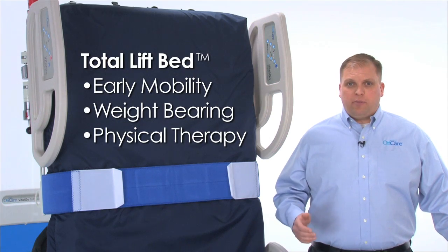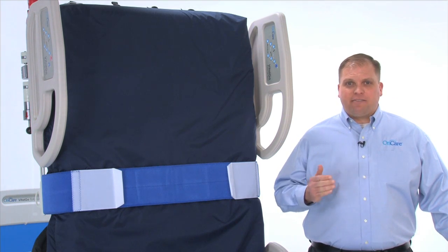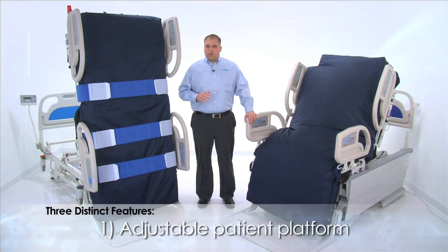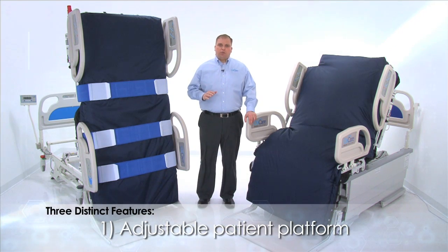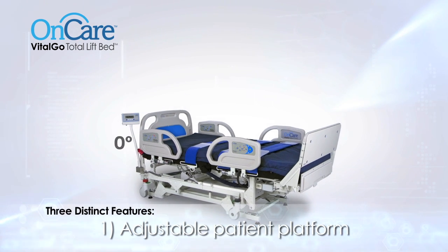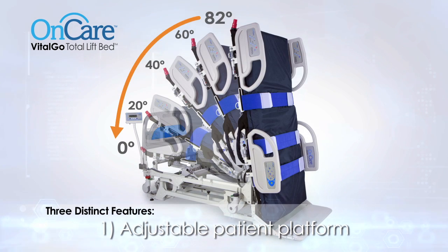While the Total Lift Bed can function as a standard hospital bed, there are three distinct features that place it in a category all its own. First, it's the only bed to feature an adjustable patient platform that tilts a patient from a zero-degree flat position to an 82-degree upright standing position, and any angle in between.